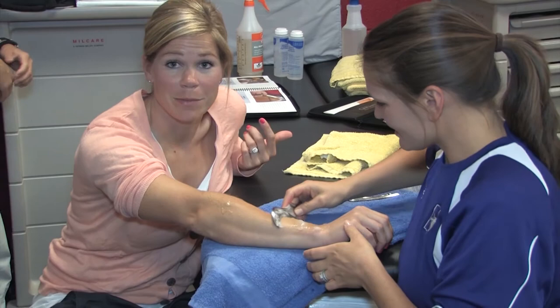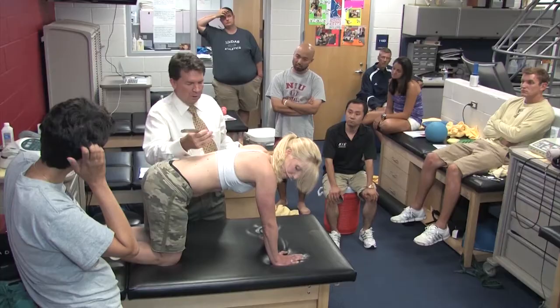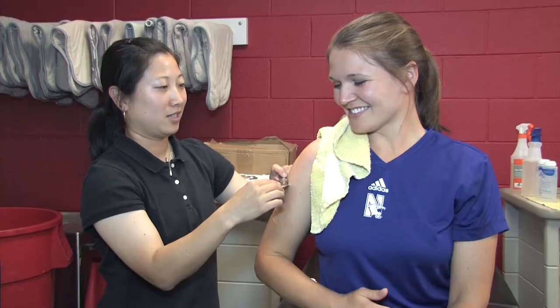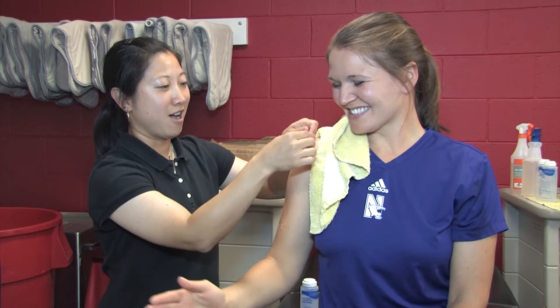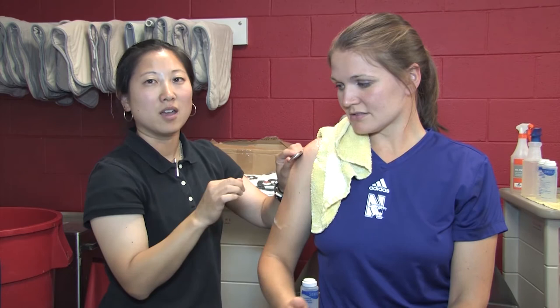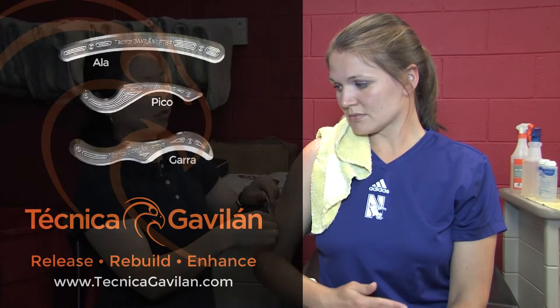Even when you think that the psoas is so deep. She is using the sweeping method and the tool to work on lateral epicondylitis. I can use the end to do my half turns between each vertebrae. I feel like I am not moving as much and the instrument is taking more of the pressure off my fingers — I wouldn't be as tired doing trigger points. I feel like I could do this all day.